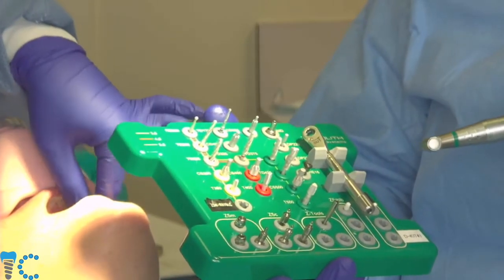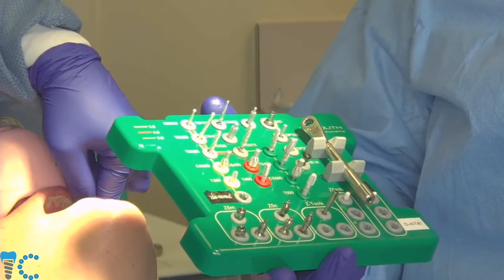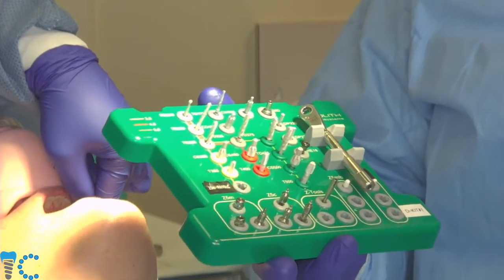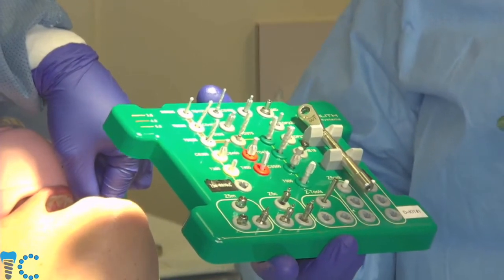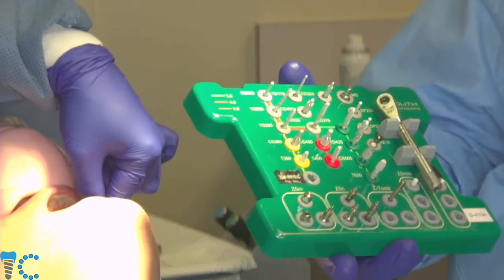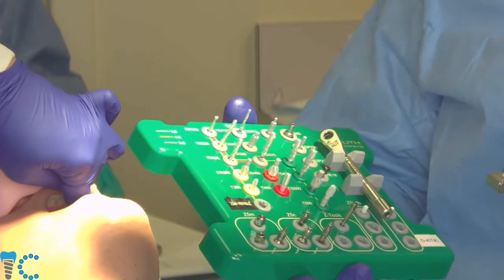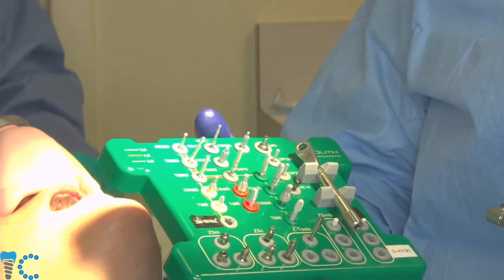So all the drilling that we're going to do is at 800 RPMs, and we could do our drilling at 800 to 1200 RPMs, and anywhere in there would be fine. And again, when I'm stepping on the foot pedal for an electric handpiece, a lot of times I'm not stepping all the way on the foot pedal, so our true speed is actually less than that. And then the only time we're going to change our speed is when we tap. When we use the implant tap, we're going to do that at 20 RPMs. And then when we back the tap out, we'll have it in reverse at 20 RPMs. So when we put the tap on the drill, we're going to double check it before we put it in the patient's mouth, just to make sure we put it down to 20 RPMs.